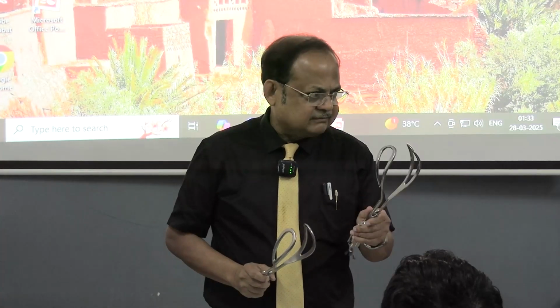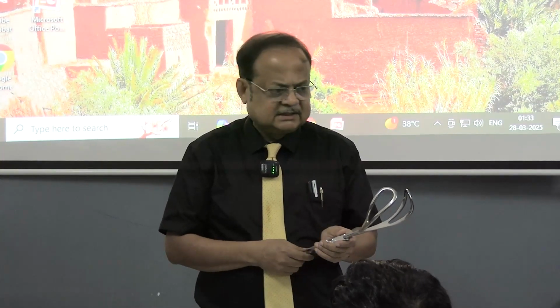You can subdivide it into gross subdivision. One is the short curved obstetric forceps, commonly known as Wrigley's forceps. This is the long curved obstetric forceps, and in India, particularly in Bengal, Das's forceps is used. Other common one is Simpson's forceps. Kedarnath Das's forceps is used.